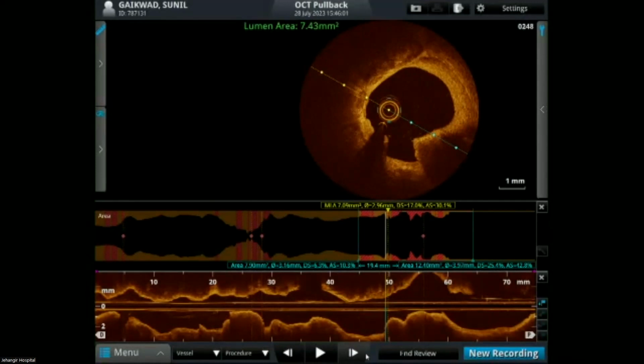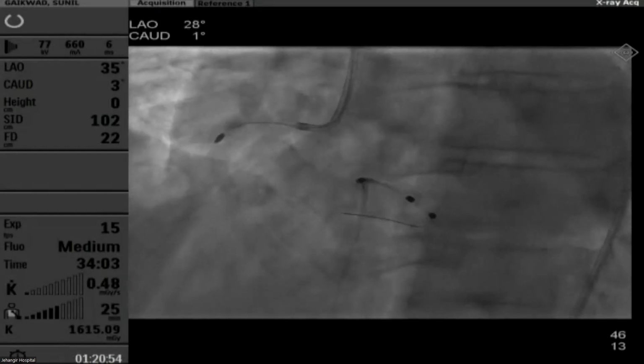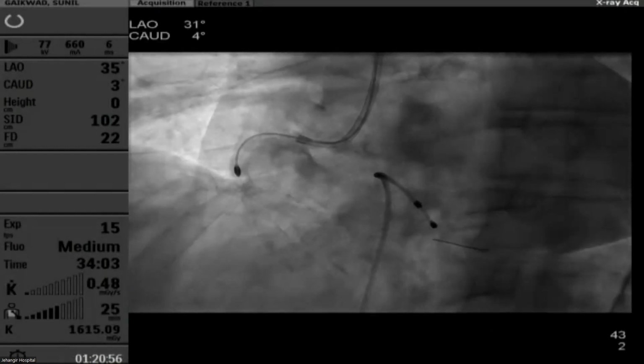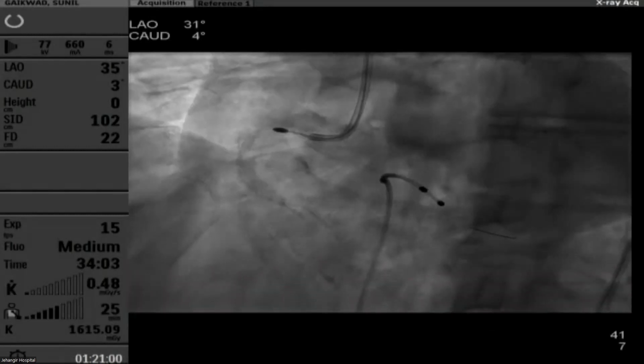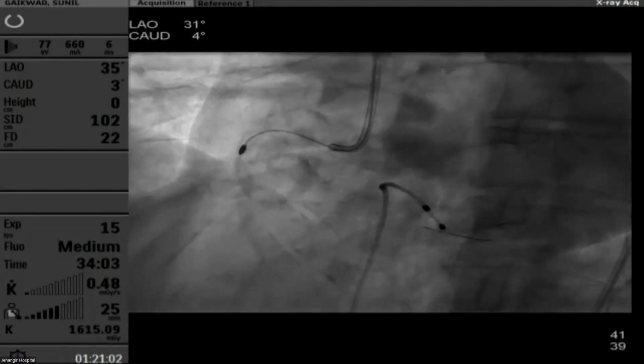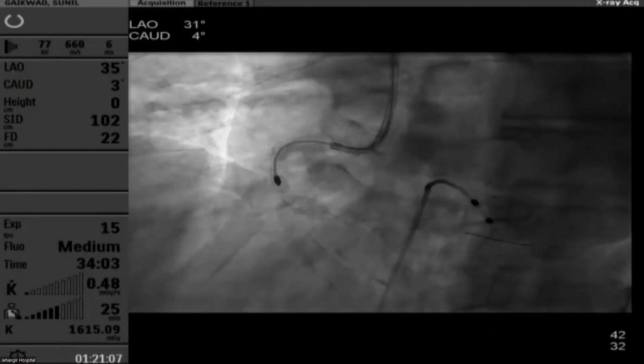Did you go up to the distal lesion with 1.75? Yes, we'll just show you. Can you show the previous angio? Two backs, another one. Now you see this is 1.75. No, forward. This is 1.75. Go next. Here you see. Go play.